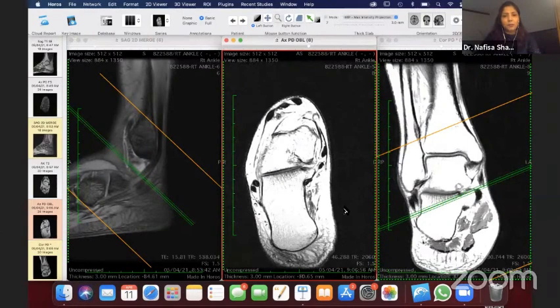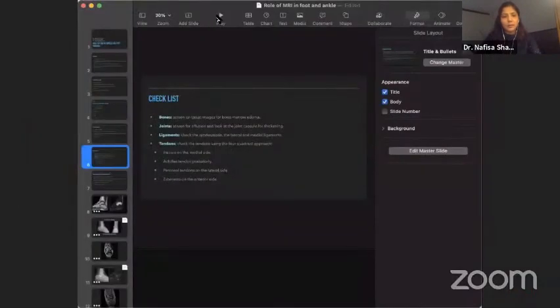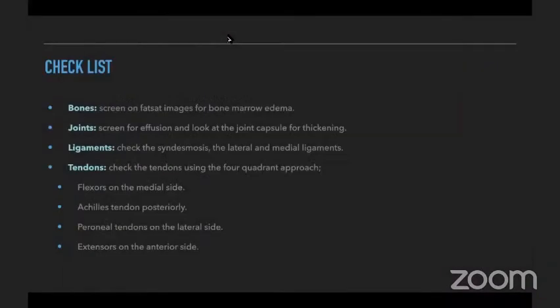Just taking you back to my presentation, and I hope you can see that. Yes, we can. Okay.